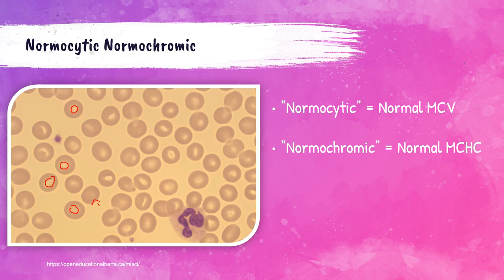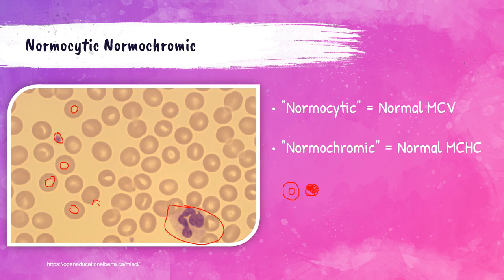If the MCHC value is decreased, the red blood cells will have an increased central pallor. These are normal looking red blood cells, along with a little platelet and a segmented neutrophil. A normochromic red blood cell will have a normal amount of central pallor. A hyperchromic cell is going to be basically all the way red — there's going to be no central pallor. A hypochromic cell is going to have a big area of central pallor.